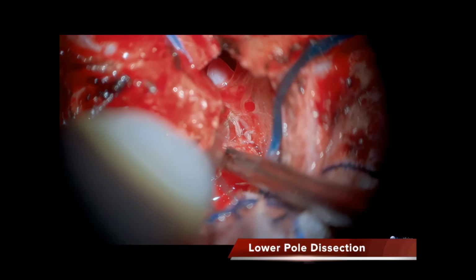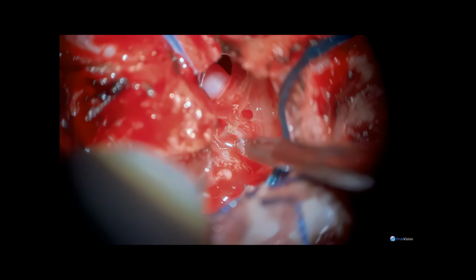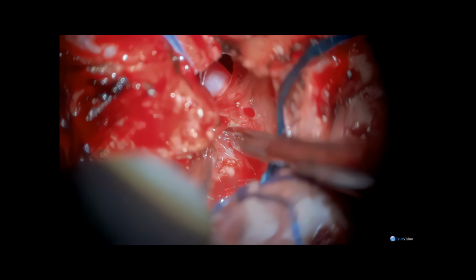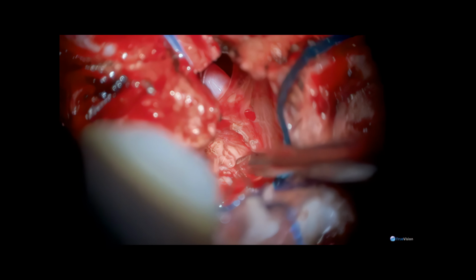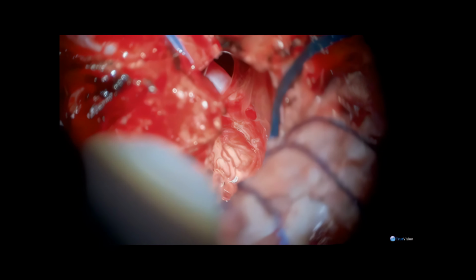The arachnoid plane is carefully maintained in order to separate the lower pole of the tumor from the lower cranial nerves and important brainstem vasculature. You can see the vertebral artery up anteriorly and separated from the tumor.